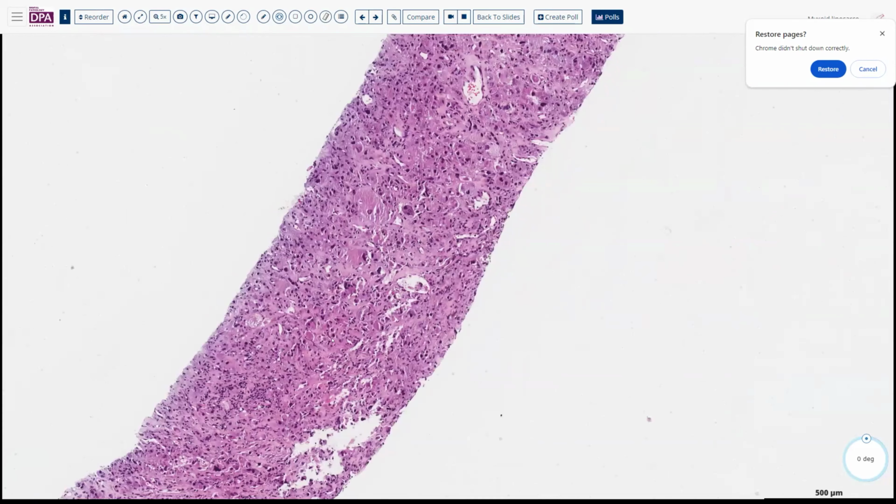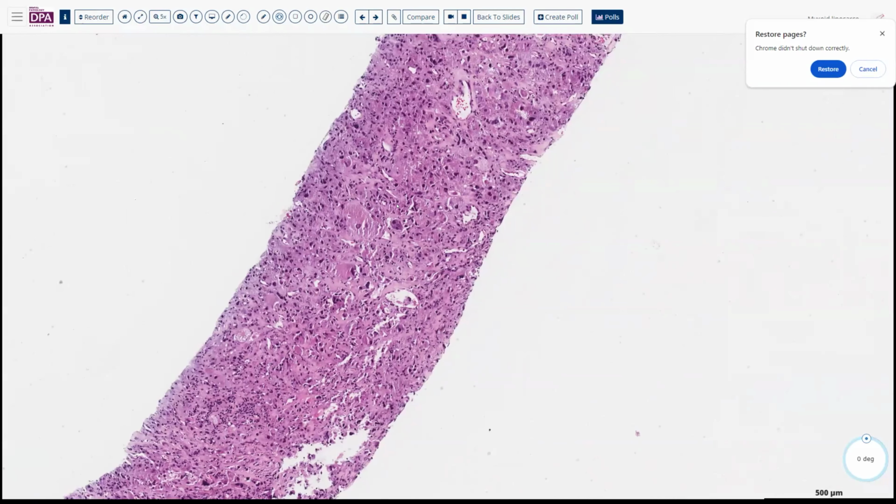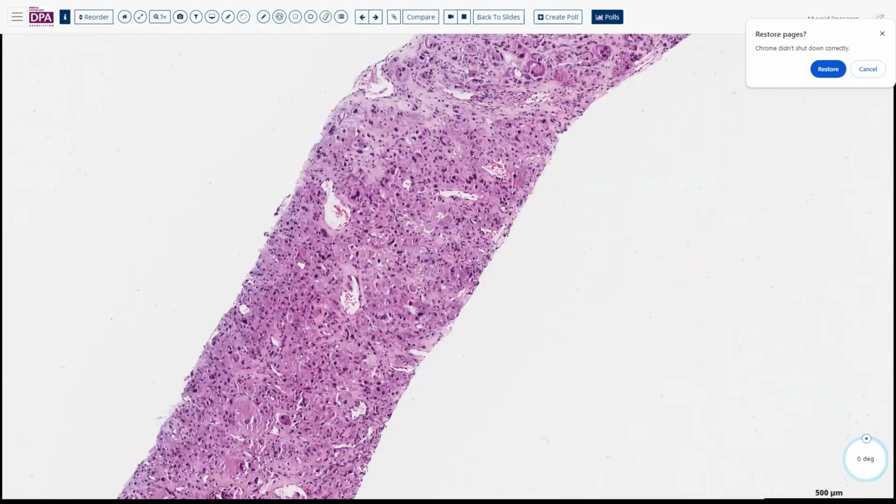Usually the sarcomas that are most commonly driven by a single fusion gene tend to have a lower grade appearance, more monotonous, not this highly pleomorphic, polyploid kind of process.